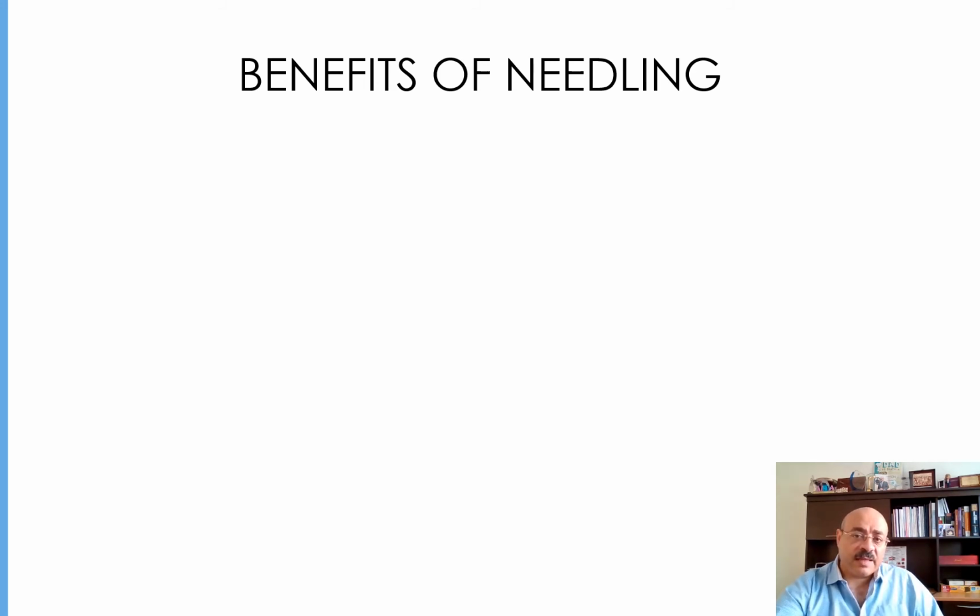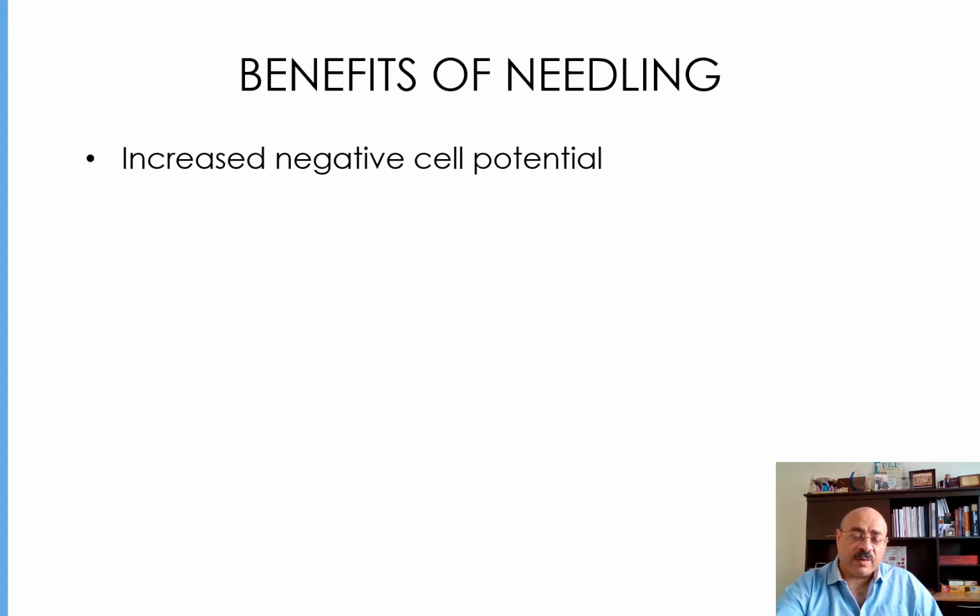So in order to summarize the benefits of microneedling, we get an increase in negative cell potential.